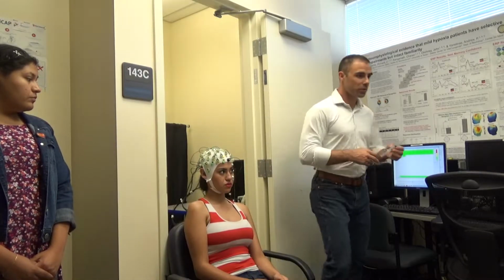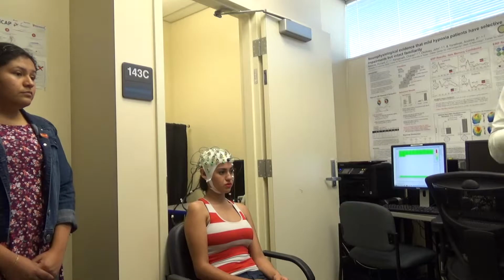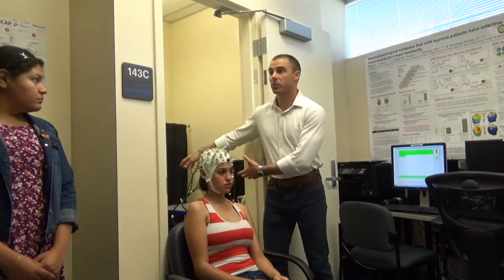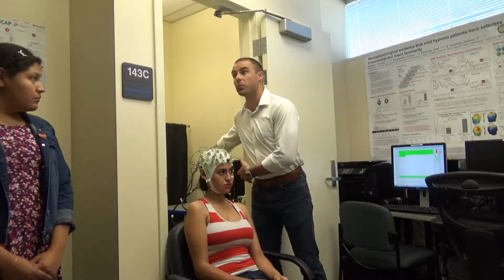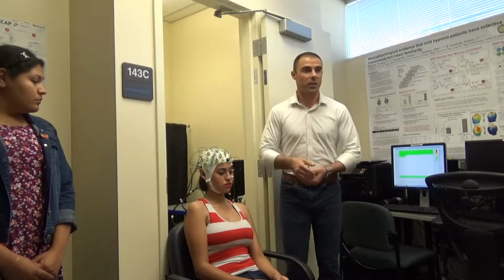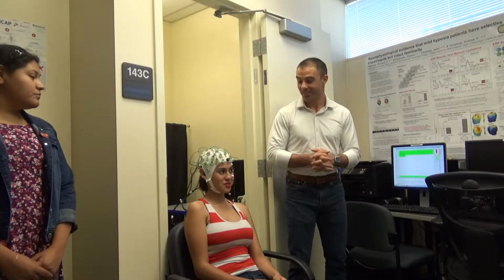Okay. So one of the things that's kind of nice about what we can do here is usually what we would do is we would kind of gently back him in like we did with Ryan the other day, and he was able to look at the computer screen and work on the experiment, right? But since we already have her out here, we can actually do a little bit of what you might think of as neurofeedback. So you can see your own brainwaves in action while she's eating her Kit Kat. And we can show you how bad that is to have happen during an experiment, as an example.